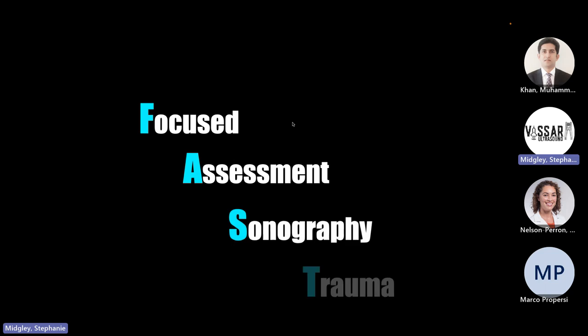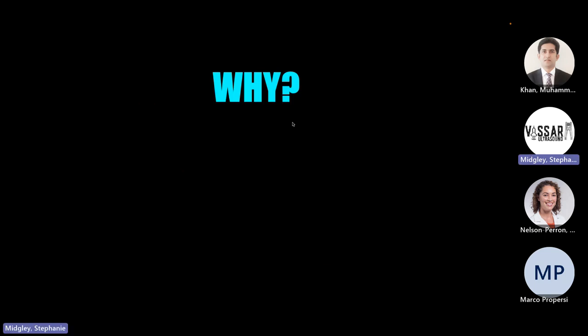So FAST, right, focused assessment with sonography in trauma. It's essentially a protocol that we use. It was originally developed for trauma, but I'm actually going to give you more of the medical workup for it, where you can apply a lot of what you find to the assessment of your medical patient. And then the E is just extended, and that's when we extend up into the lungs. A lot of the FAST things that we're going to cover, we will cover again for echo, for lung, and for renal. So this is a big, long lecture, but it's an overview to help you see the spectrum of what you're going to learn.